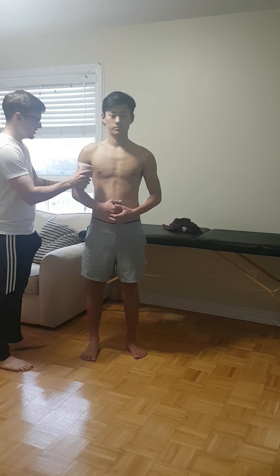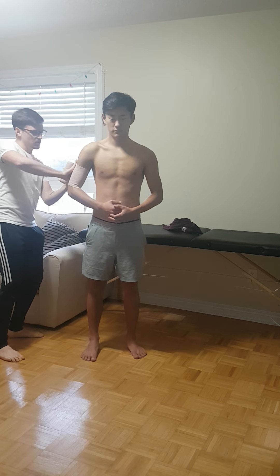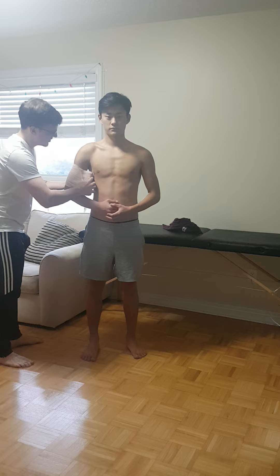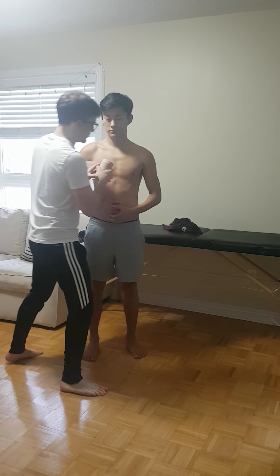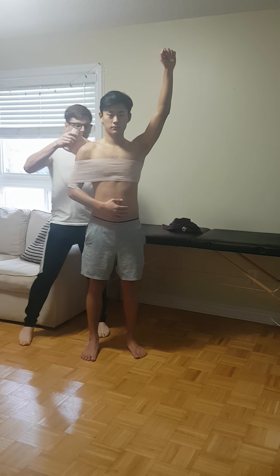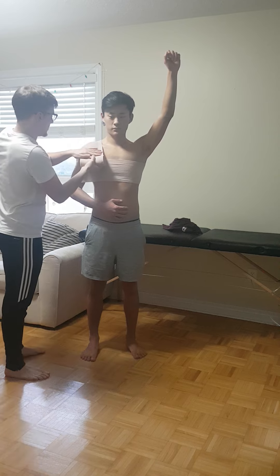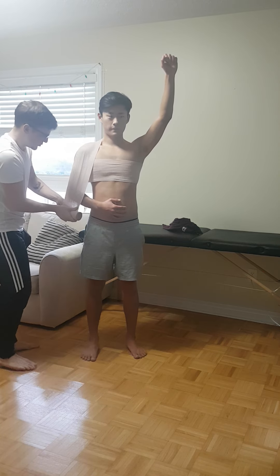So the first part of this is the spika. I'm just going to tuck through here — try to move you as little as I can. We're going to come through a couple of times just for support. Now we come across the body — just lift that arm. Come around. Now we come up and over. This is the spika aspect, making sure we come nice up and over the shoulder with a little bit of pressure down.